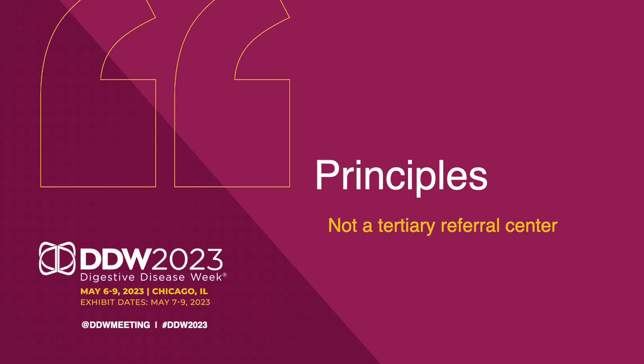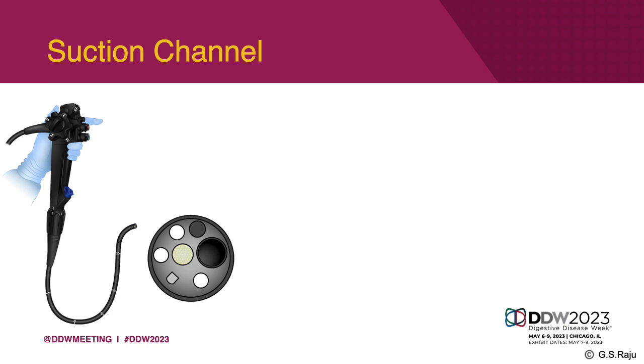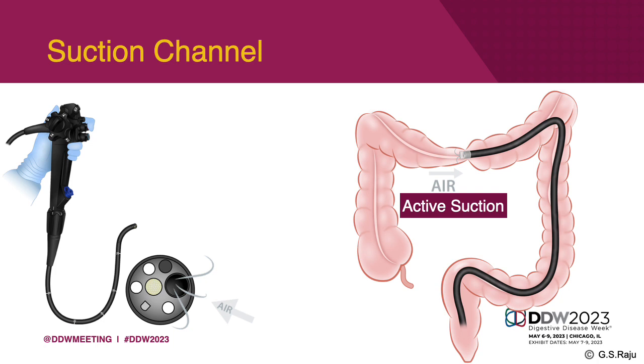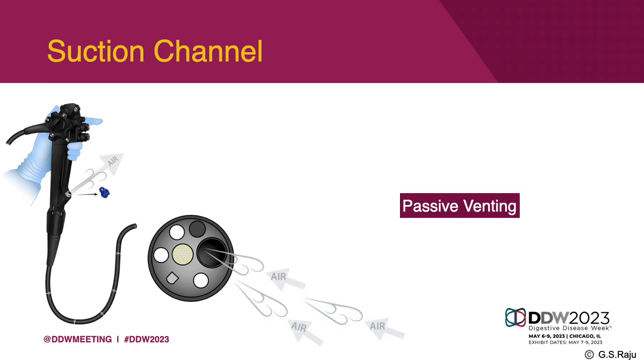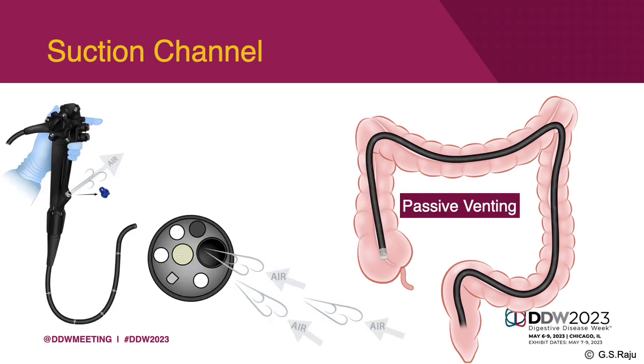I would like to take a little bit of time to share some other principles of how to use the suction channel. When you apply the suction by pressing on the red button, you create active suction that leads to collapse of the air column just in front of the scope without necessarily shortening the length of the colon. Instead, if you try this technique that I've used in my practice, that is passive venting by removing the biopsy port when I'm struggling to go through the colon, what it does is it shortens the colon and allows you to get to the cecum easily. So, active suction, passive venting, things to keep in mind.